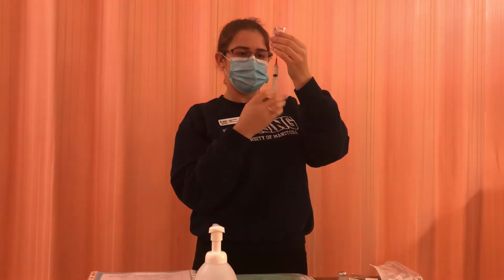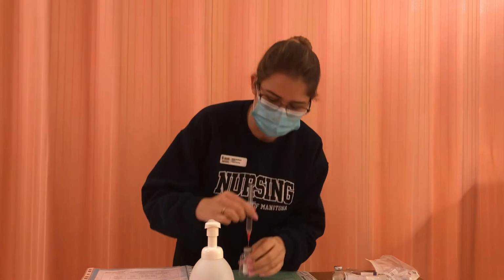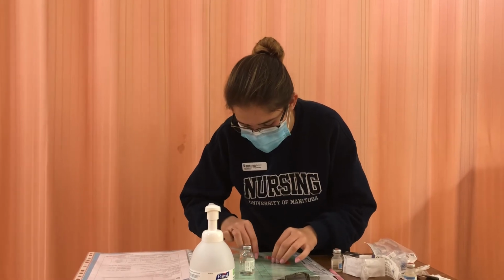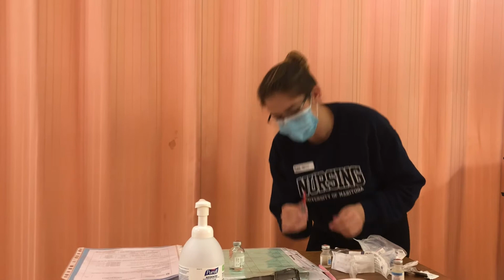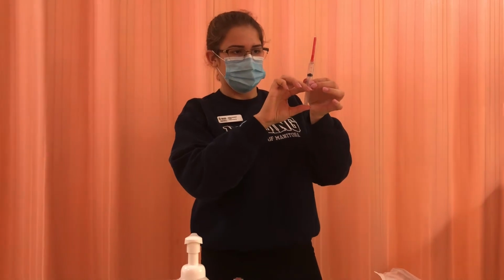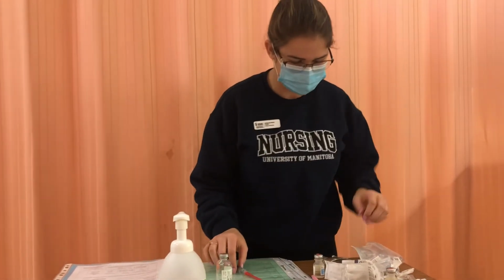And I'm just going to look at my PDM here. So for azithromycin, also known as Zithromax. Okay, so I'm just pulling a little bit extra just so that I can take out my bubbles. So I'm using the swoop and scoop method to put on my cap, and I'm tapping the bubbles out. I'm withdrawing the bubbles from the top, and I'm making sure that I have the right dose. So I have 3 mLs. So just rechecking with the PDM, and that's what I want according to my MAR.